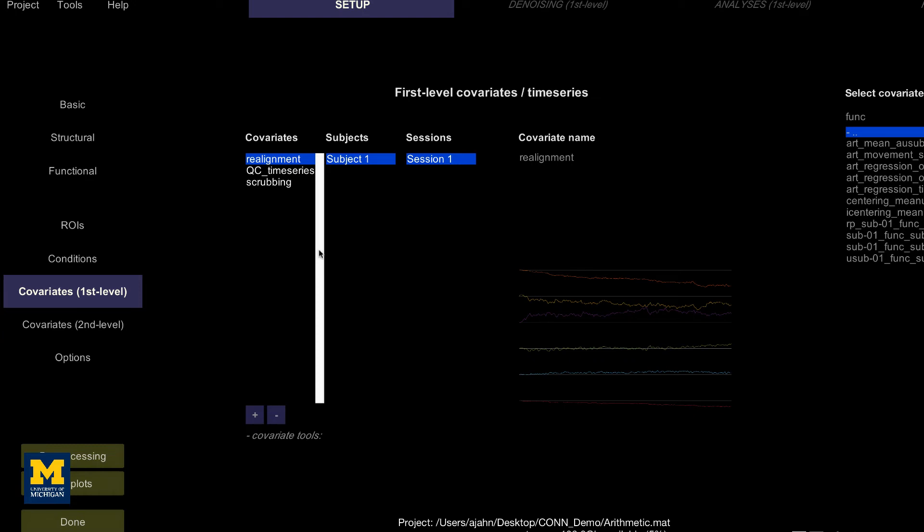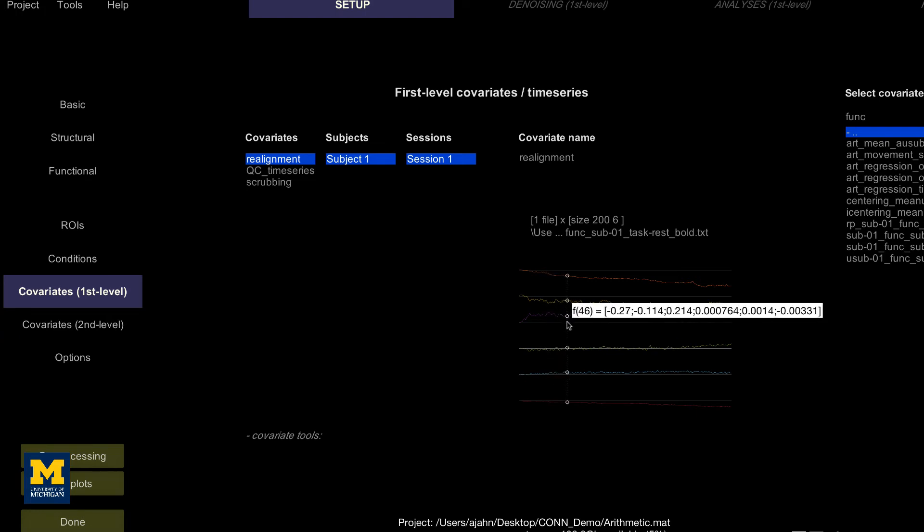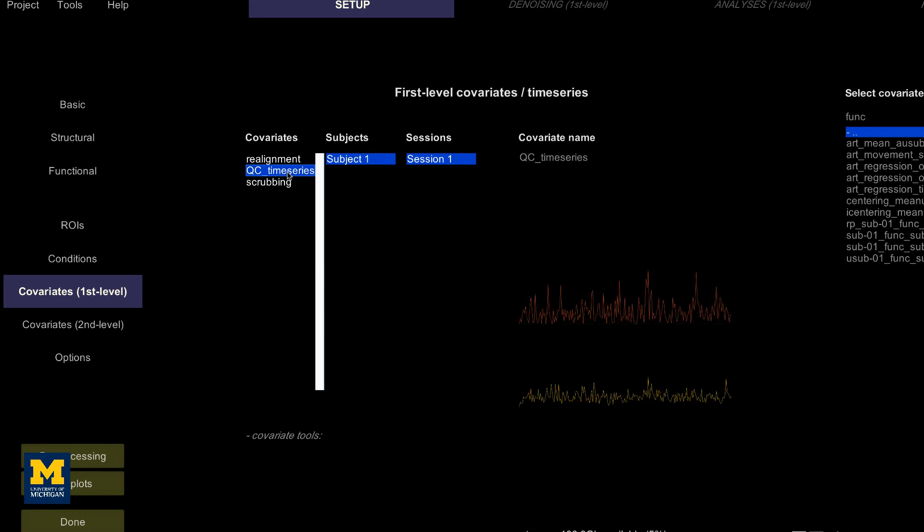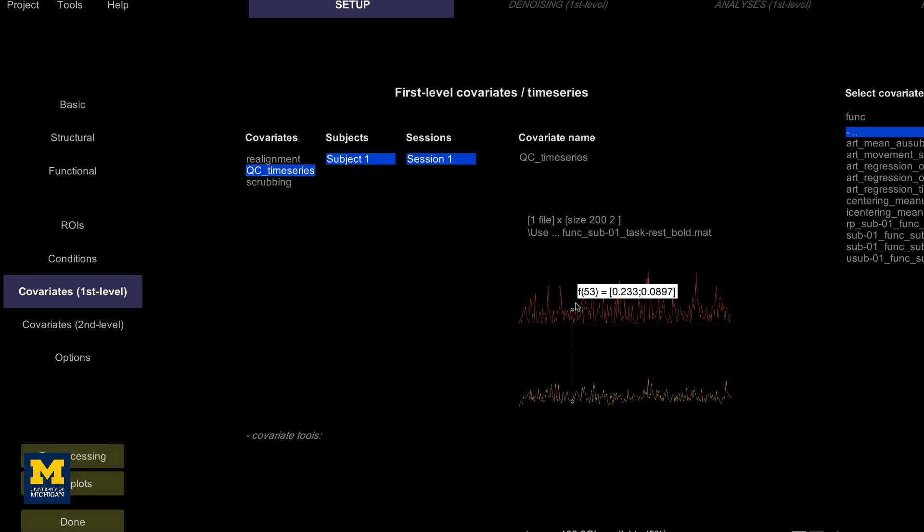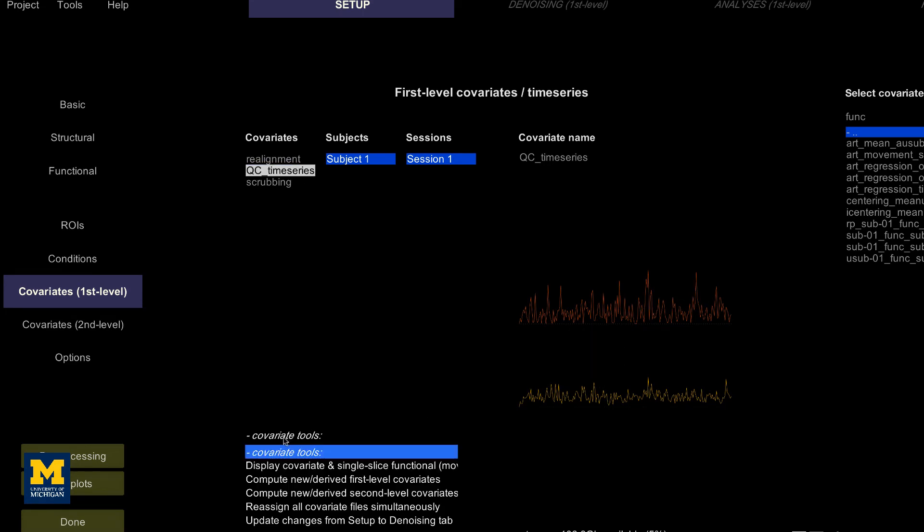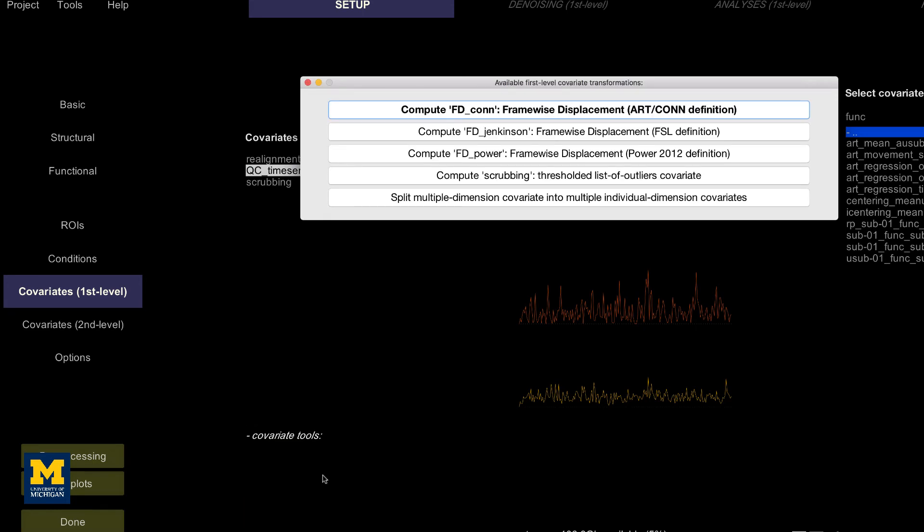The realignment covariate is a set of six movement parameters representing movement in the three translational and rotational directions. Hovering the mouse around the movement parameters will display a vector of six numbers representing the average motion in all six directions at that time point. The second covariate, QC time series, computes an additional measure of motion called framewise displacement, or FD, a type of composite measurement of all of the movement parameters. The default in CONN is the FD computed by the ART toolbox. If you want to use another FD formula, click on covariate tools and select compute new derived first level covariates, and you can select from any of these options.